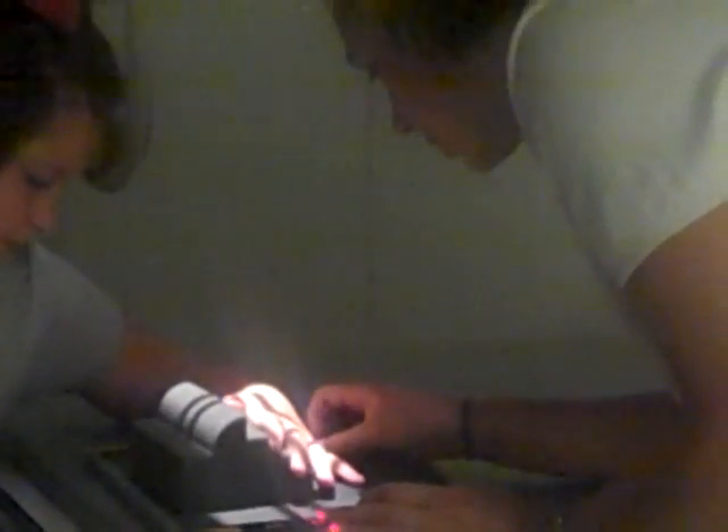It looks like I need to move her just a hair to keep her in the middle of the cassette. Going to put my marker down by the wrist area again, making sure it's outside of the shadow. And now I need to realign my light field. Double-checking to make sure that all of the shadows of the fingers lie in there and that the fingers are not overlapped.